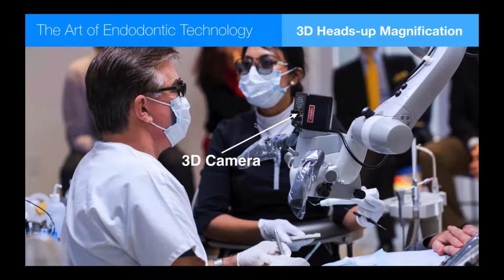I can put it to the side of their face and see the stop of an instrument coming down in a perfect right angle, so there's no parallax errors in my length control. It's just everything's more relaxed. I don't have to look into oculars.